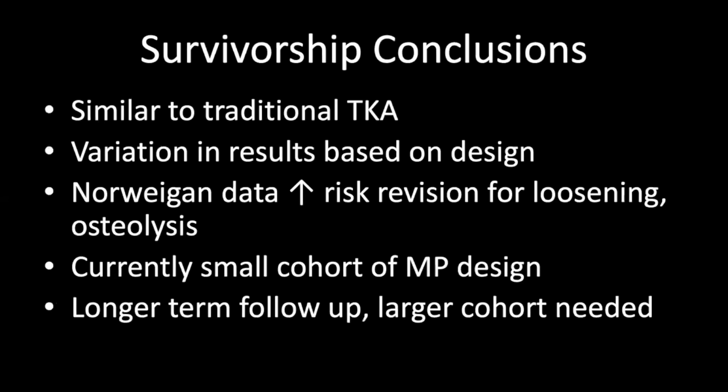When we look at survivorship, it appears that the medial pivot design has a similar survivorship to traditional total knee arthroplasty, but there does appear to be variation in results based on design. The Norwegian data raises some concern for increased risk of revision due to loosening and osteolysis, but there was a very small number of patients in this registry, and longer-term follow-up and a larger cohort is needed to gain further information about survivorship comparisons between the medial pivot total knee arthroplasty and traditional total knee arthroplasty designs.